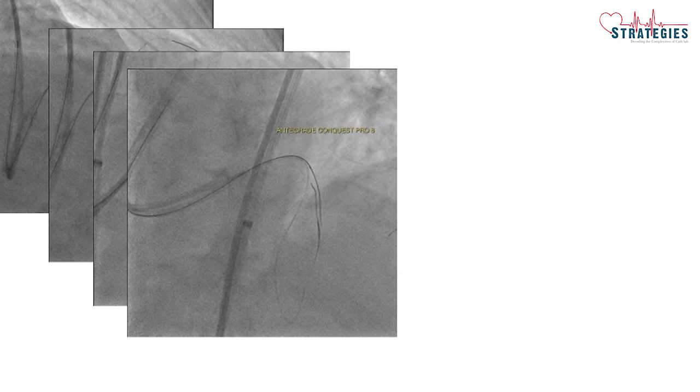There is calcium at the proximal block in this patient, which I'll show you in the subsequent IVUS. That calcium was preventing my Gaia wires, all antegrade wires, and even the retrograde wire from coming back into the true lumen. So this calcium is directing all the wires subintimally. So I took a Conquest Pro, and I directed it into the LAD antegrade.